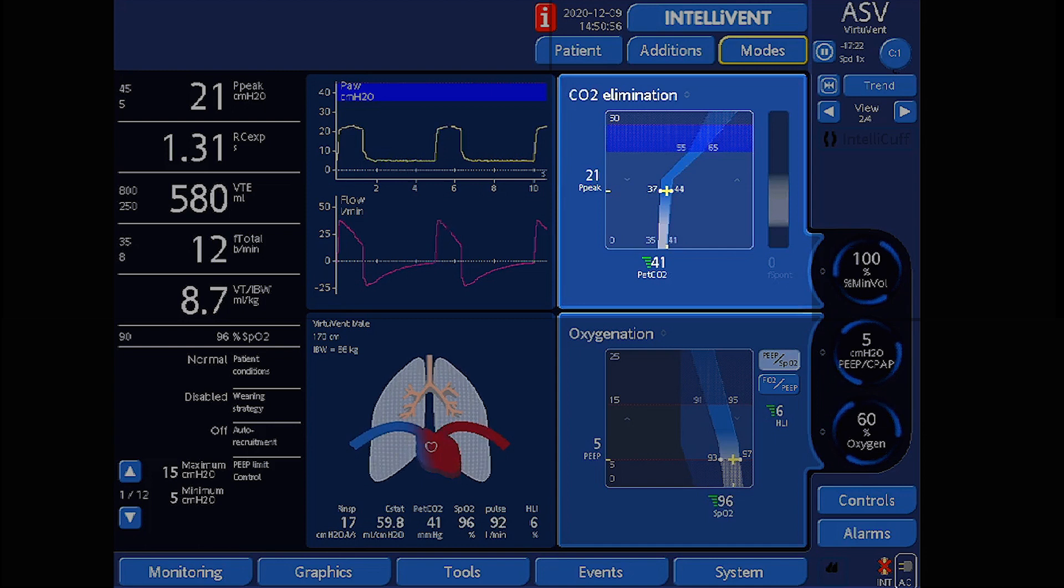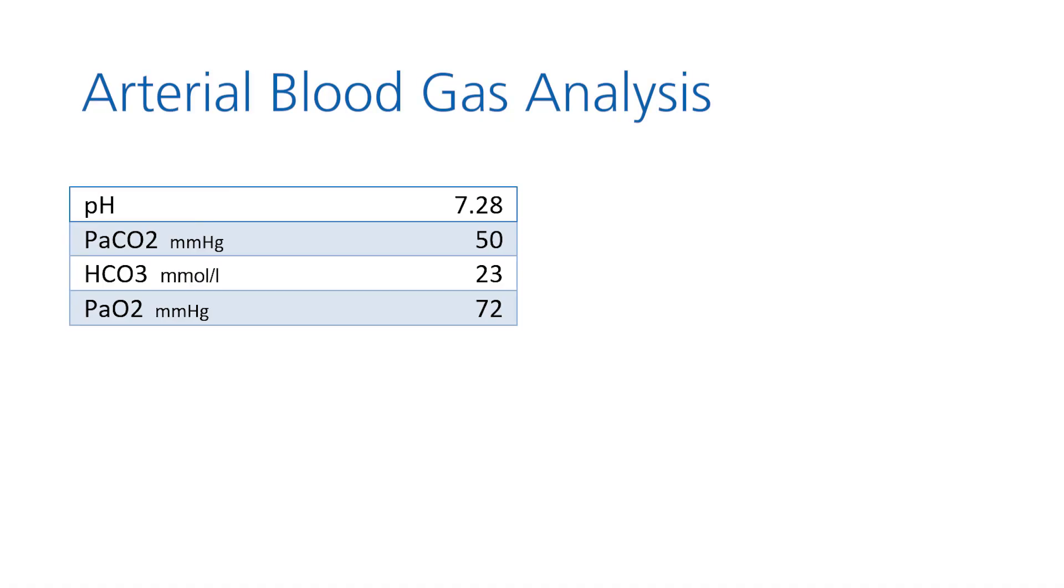30 minutes after starting ventilation with IntelliVent ASV, the patient's PET CO2 value, which is indicated by the small yellow cross, is now in the middle of the target range at 41 mmHg. A blood gas analysis taken at this point results in the values shown here.